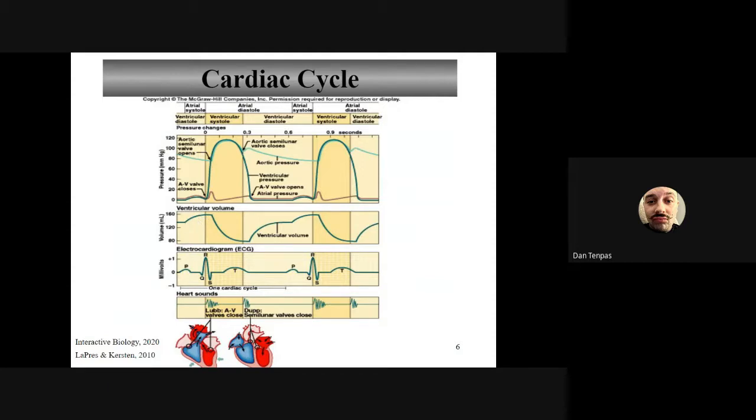All right, now if we move into the QRS complex, we have a depolarization of the ventricles, and that's going to be, again, quite larger simply because it's a larger structure, and that's going to cause ventricular contraction or systole. Ventricular systole is going to go on now. And when those ventricles contract, the pressure goes up significantly. And we do see that up here. If we look, the pressure goes quite high.